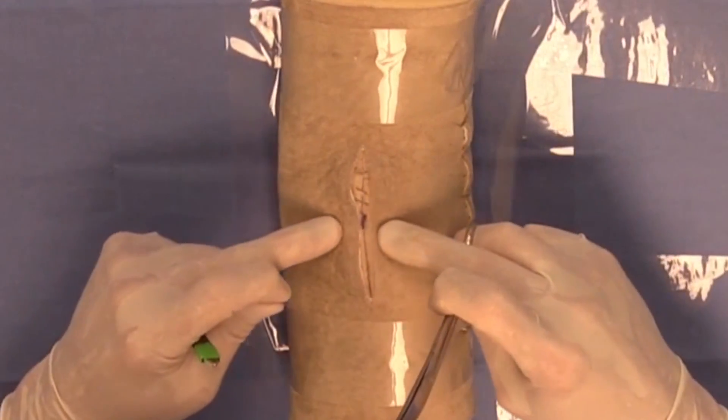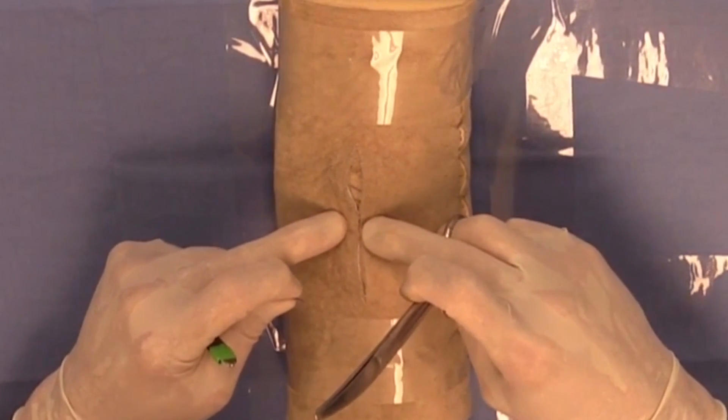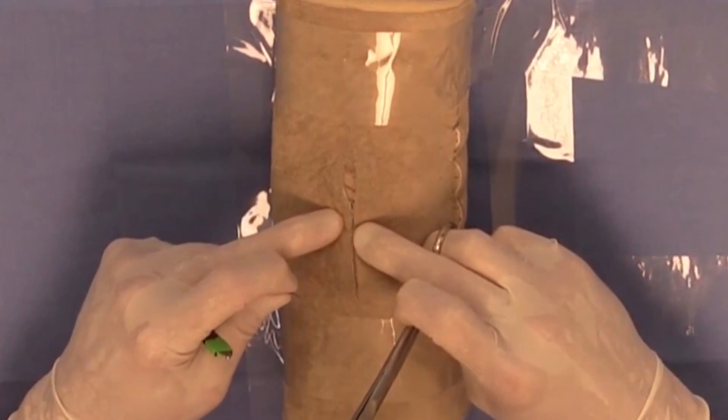Thus when you go ahead and create your skin suture you'll properly bury the knot of your simple continuous subcutaneous closure.